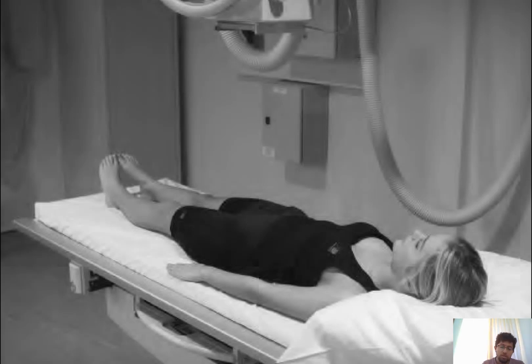Whenever the patient is lying, the patient has to lie in such a way that the patient's sagittal plane is perpendicular to the cassette. The cassette should be perpendicular to the patient's sagittal plane, and this we maintain by keeping the anterior superior iliac spines equidistant from the cassette on either side of the patient.